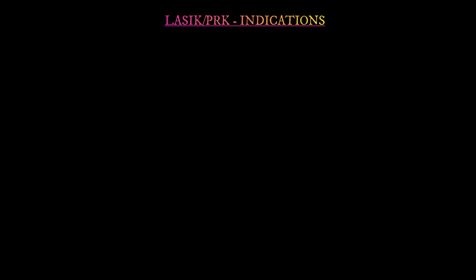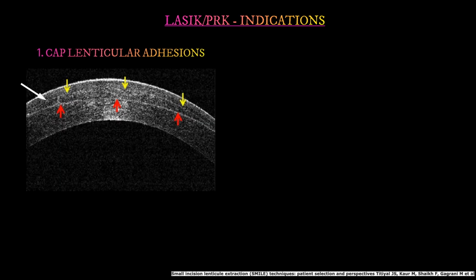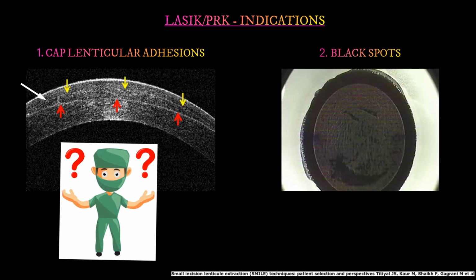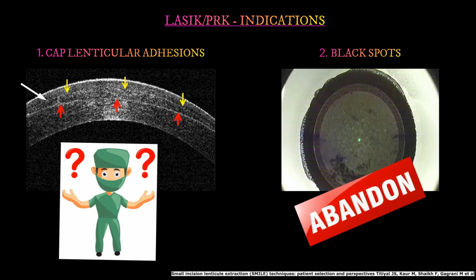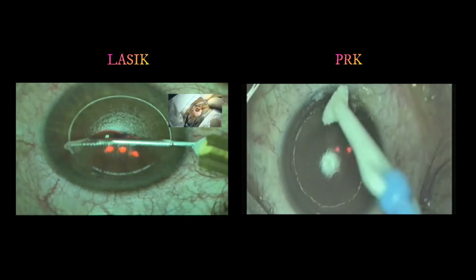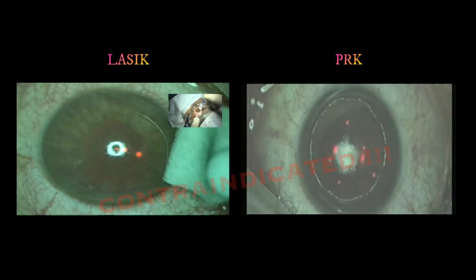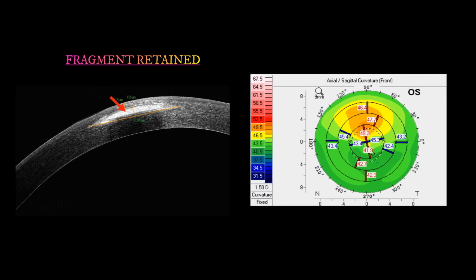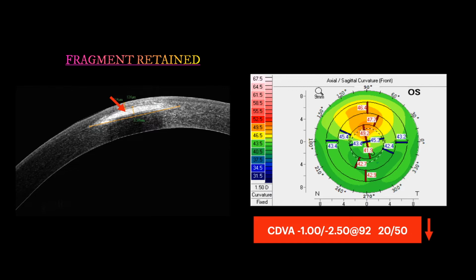Refractive correction using LASIK or PRK is indicated whenever the whole lenticule is retained due to cap lenticular adhesions, but when the surgeon is not confident to perform surgical exploration, or whenever significant areas of black spots are seen during laser delivery, forcing the surgeon to abandon the case. LASIK or PRK, however, is contraindicated when a fragment of lenticule is retained, resulting in significant corneal irregularity and loss of CDVA.